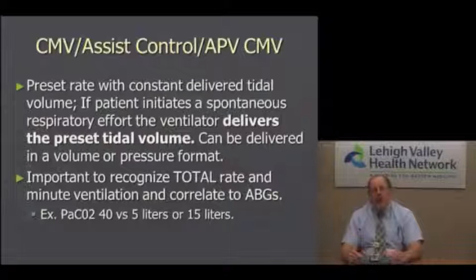Because down at the bottom here I'd say, if you have a patient who is on 500 times 10 and their minute ventilation is 5 liters and their CO2 is 40, one could make an inference that, hey, that's normal CO2 elimination for that minute ventilation, so that patient doesn't have a lot of dead space ventilation, so that patient's lungs are fairly healthy.